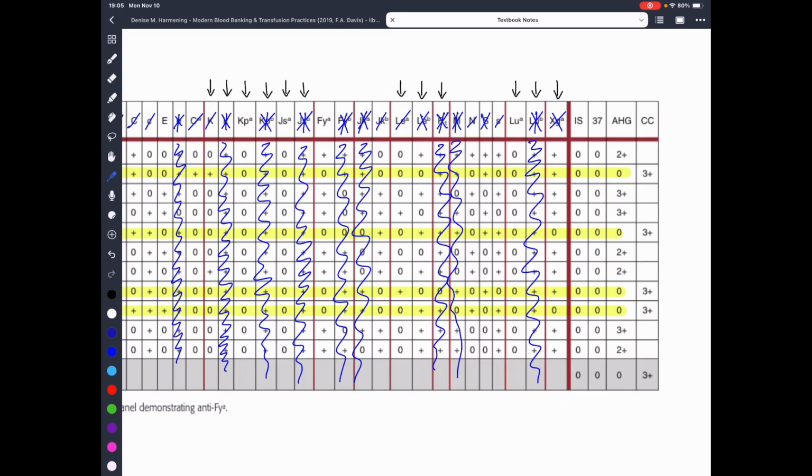If none of these other antigens explained the reaction, we would have to do further testing like the textbook stated in chapter 10. We would have to pull out a different lot number, because different lot numbers have different reagents, and find a lot number that has at least 3 KPA, because the book explained the rule of 3. You want at least 3 where they're homozygous, 3 where they're heterozygous, and 3 where there's nothing present.